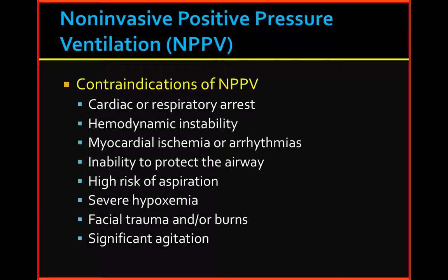In other words, if you set the mode to AC, set a volume, and set a rate of 12, the patient can never breathe less than 12 times per minute. So this mode is really nice, AC mode, and he said it's like the most common one used in ICUs everywhere, because it can be done either on the awake patient or the totally sedated patients.